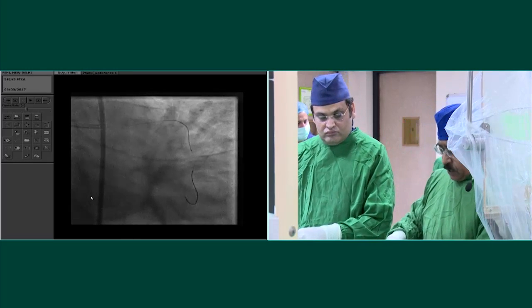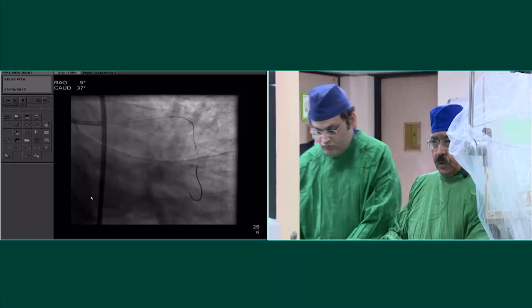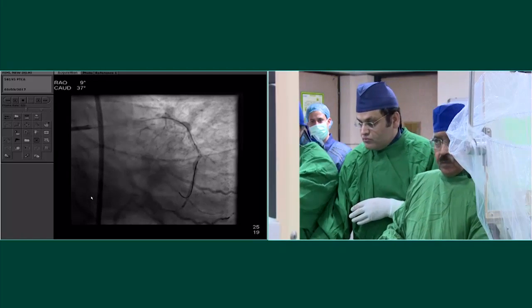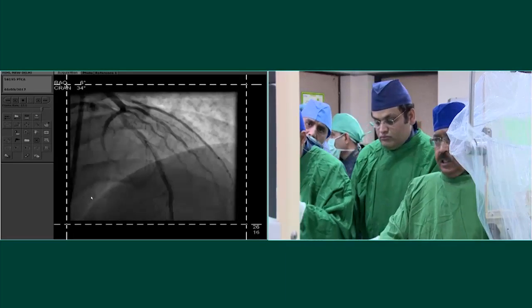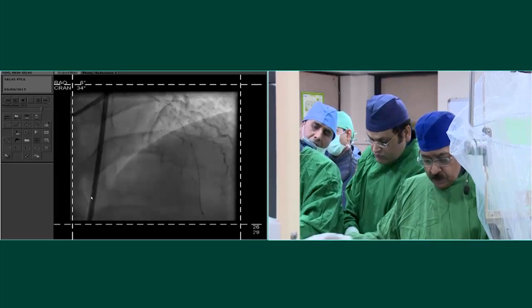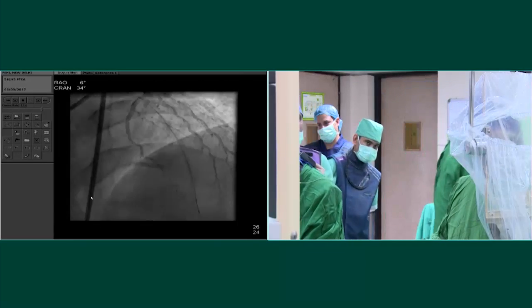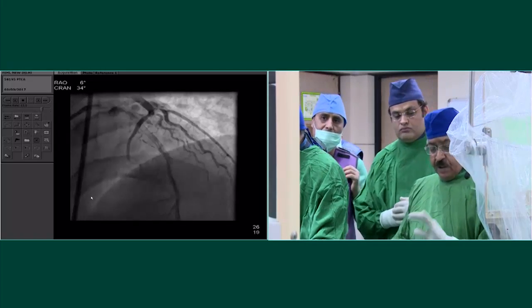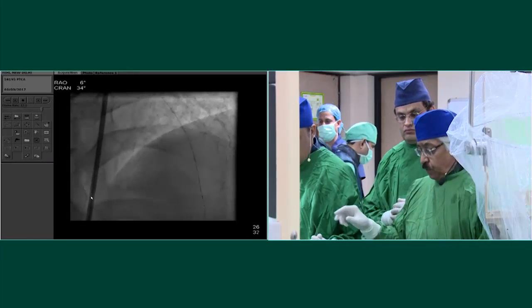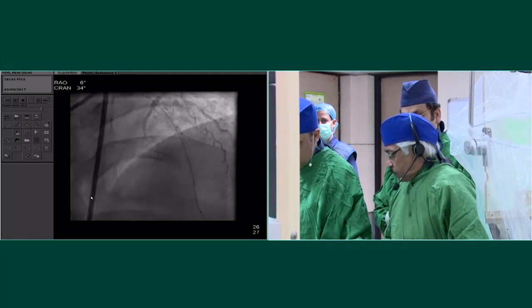Okay, so let's look at this in both views. Let's go cranial. And now we've given nitro and everything else. So here we are. We're going to do the OCT. What was the pressure of the cutting balloon? The 6 at 7 atmospheres. It reaches its nominal by 6 atmospheres.